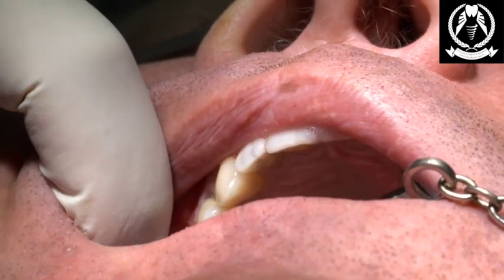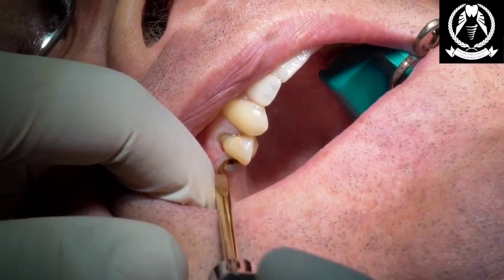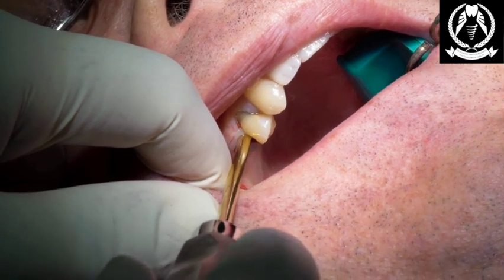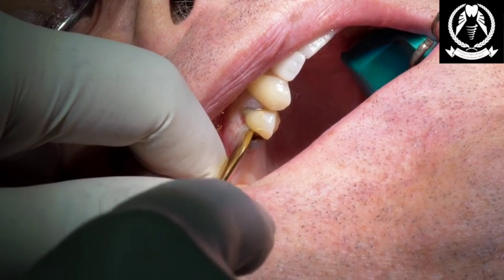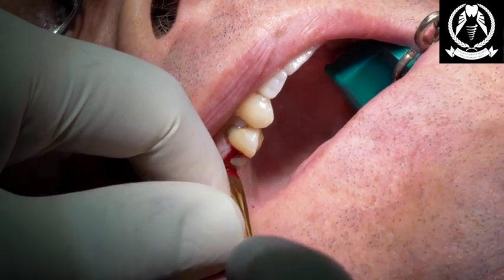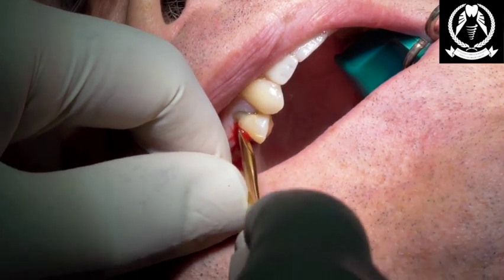Perfect. Yep, so Alan can talk to us, and we're under a mild sedative. I'm going to start by extracting the roots by just slowly breaking the periodontal ligaments between the tooth and the bone, with gentle pressure on the actual root faces themselves. They're quite loose anyway, so just gentle pressure, creeping around with the luxator there. My nurse will just aspirate so I can see what I'm doing.